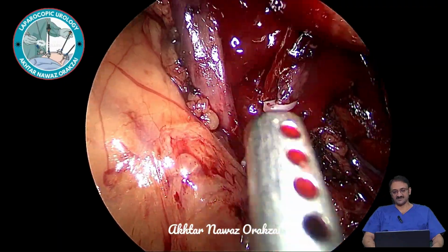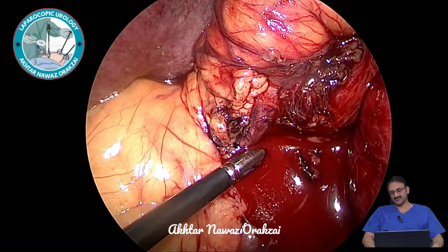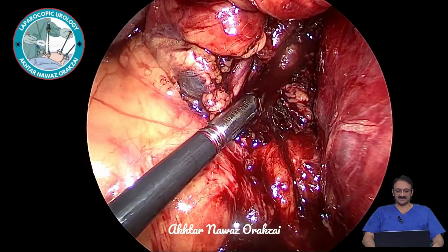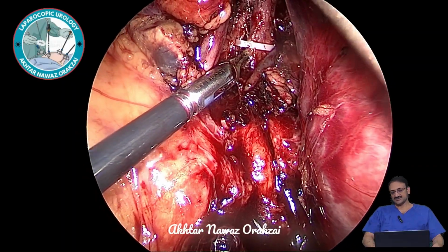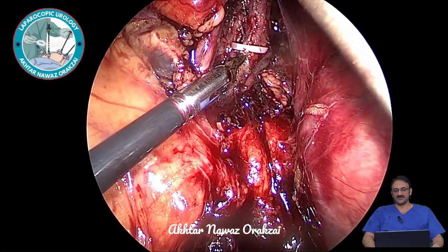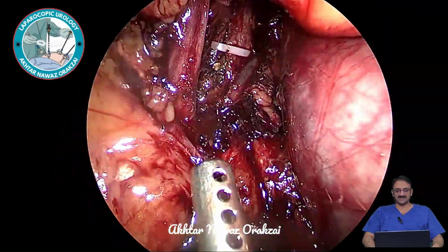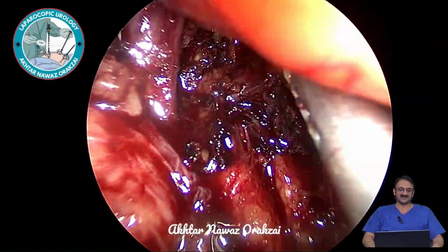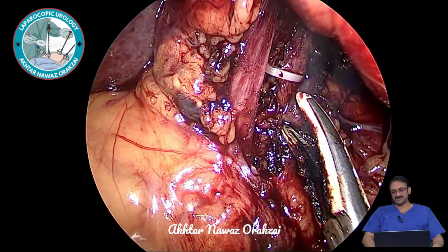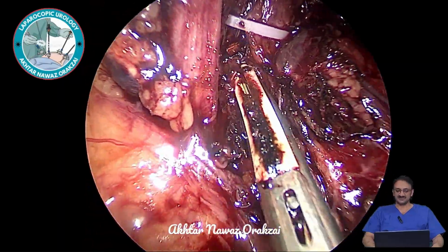So we take down the vein coming in the way, but we find that we have opened that ligated or transected artery. There was no other way, so we used our bipolar, the Escolab bipolar, an excellent instrument. It has been my friend for 8 years. So it stopped bleeding. But we know that this is just a temporary control.